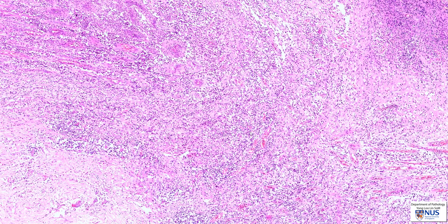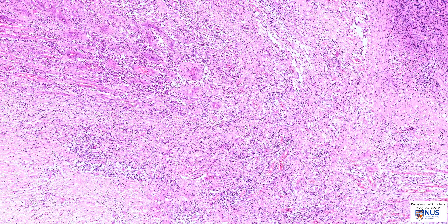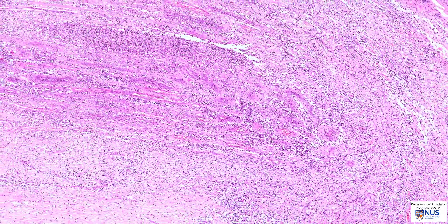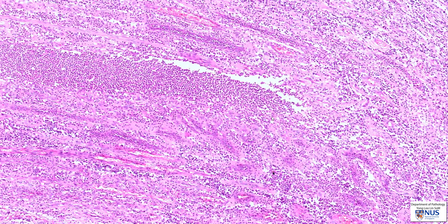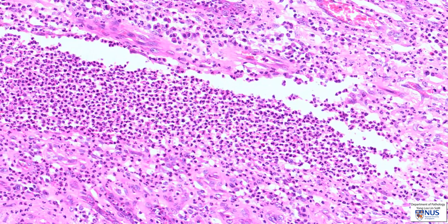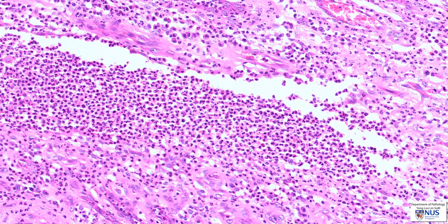Moving deeper into the tract, we continue to see small blood vessels and lots of inflammation, and as we go still deeper, there is an area where there is more heavy acute inflammation. Sometimes there can also be abscess formation, and sometimes the abscess precedes the formation of the fistula.